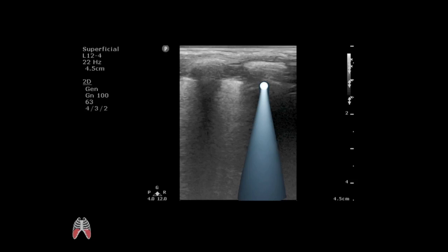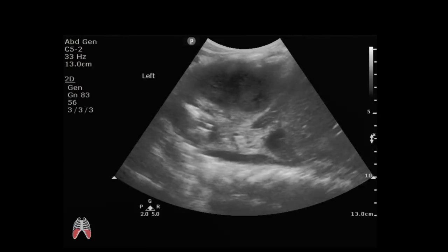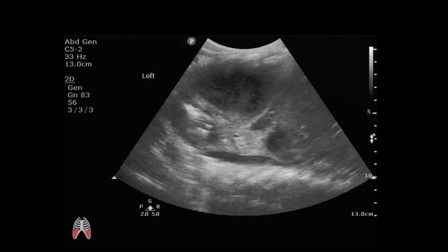Remember, the B line goes straight from the pleural line all the way down, as opposed to just a lung comet tail artifact. But if you see this, there's got to be something going on. Okay, great. What are we seeing here? Give me a few things. Just yell it out. Go ahead. Good. Spine sign, I heard. What else? Consolidation, great. Good, like that. What else? You got one more.